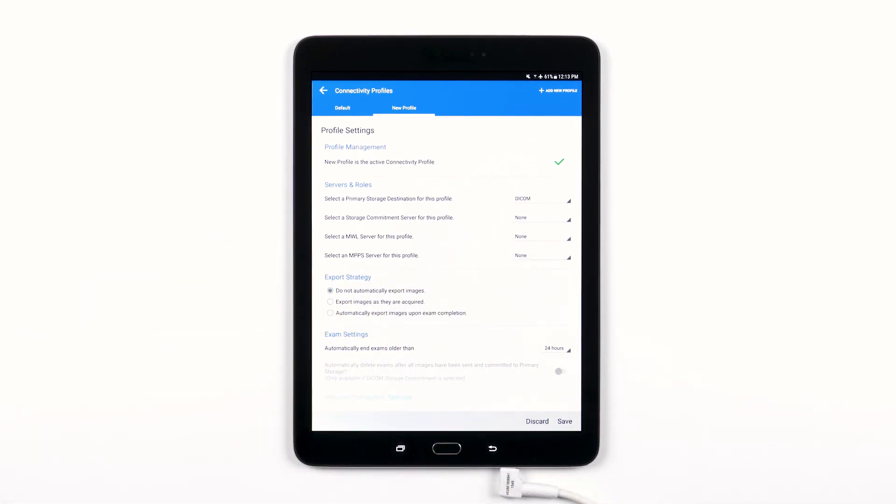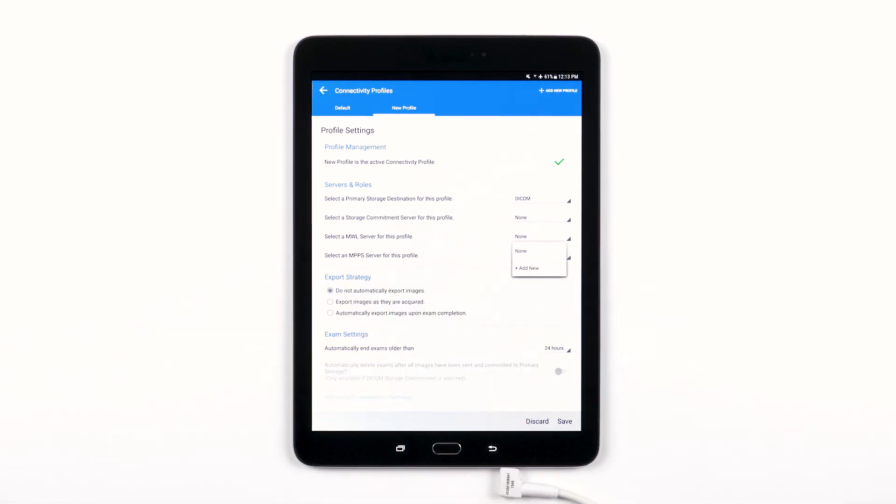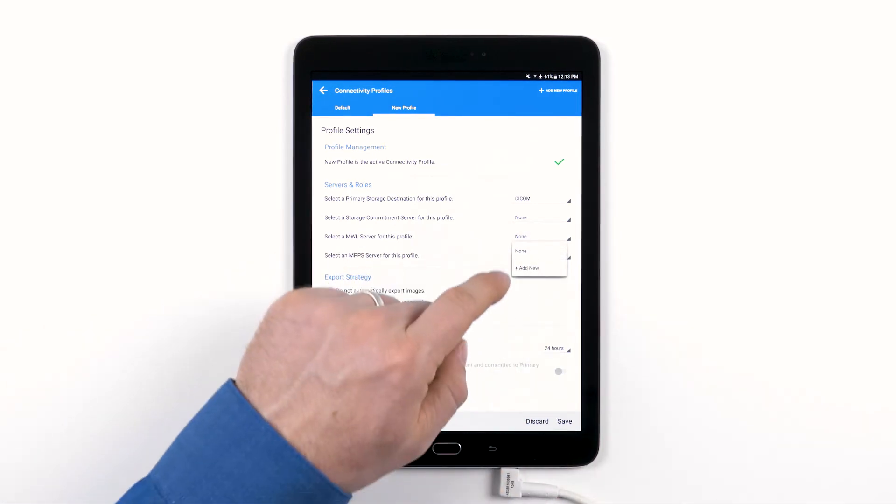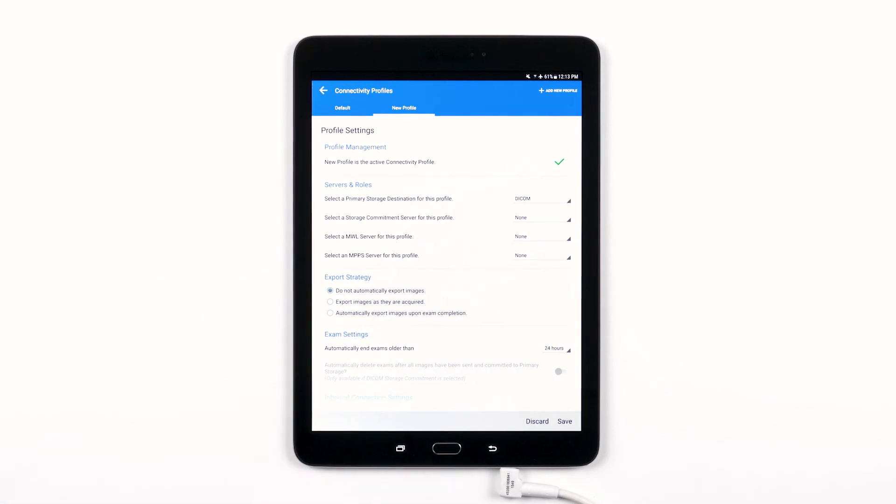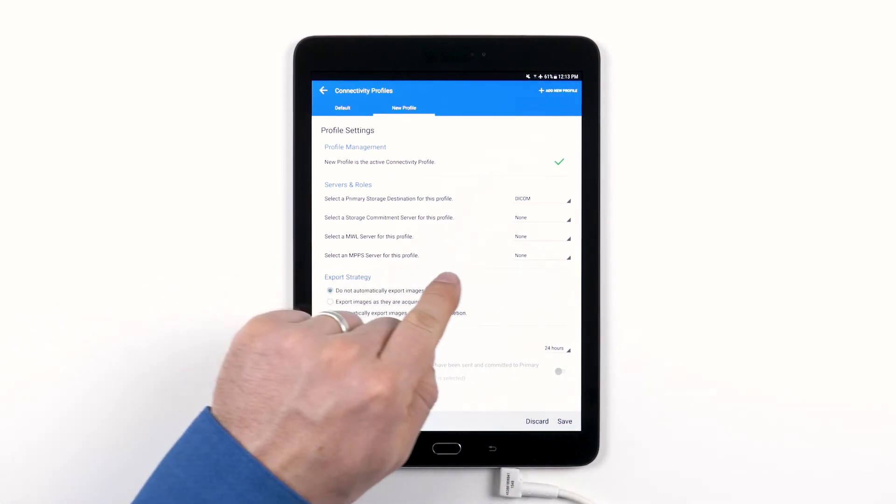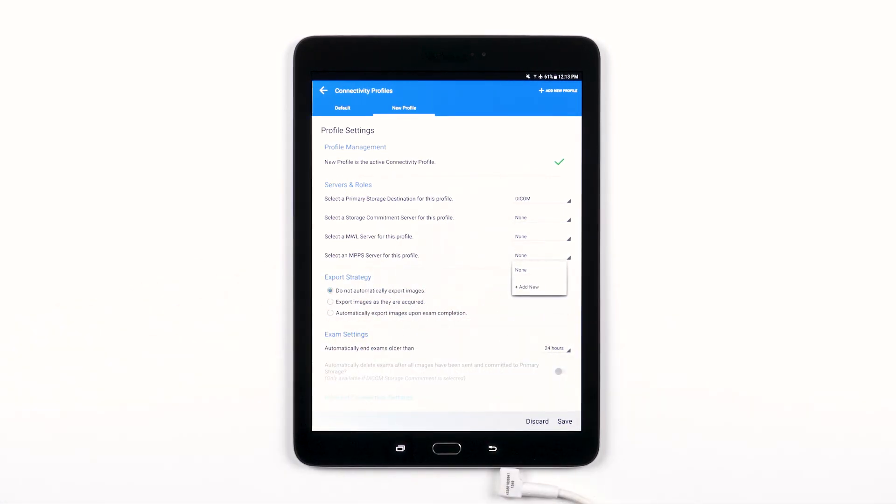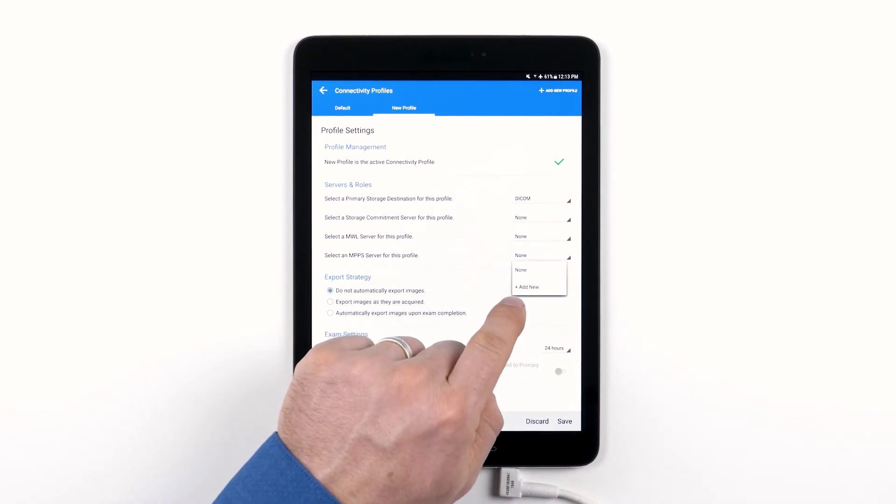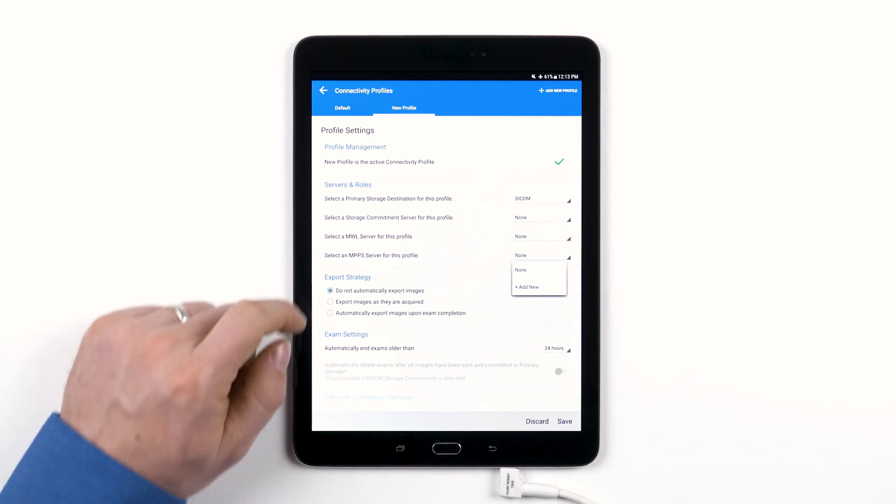This is where you will select an existing modality worklist server or set up a new one through a similar process as shown before. Similarly, if you have an existing modality performed procedure step server or MPPS server, add that server by tapping where it says None and tap Add New to walk through the process to set up a new one.